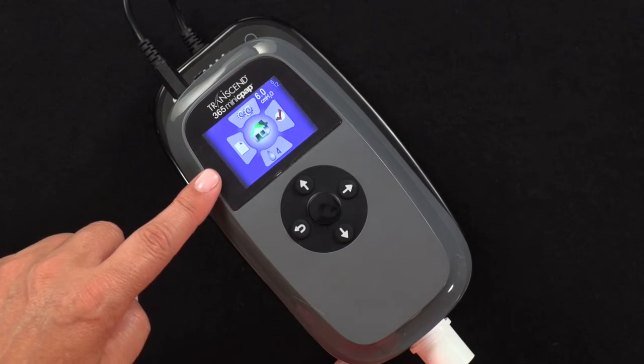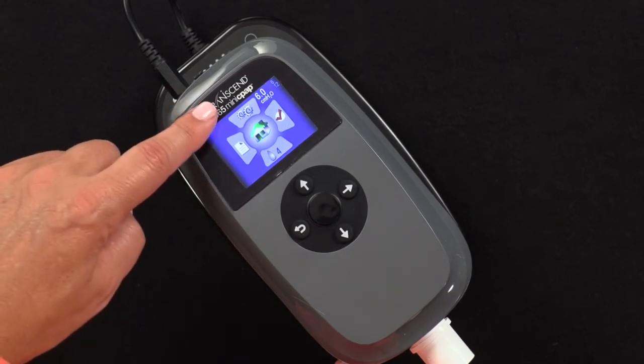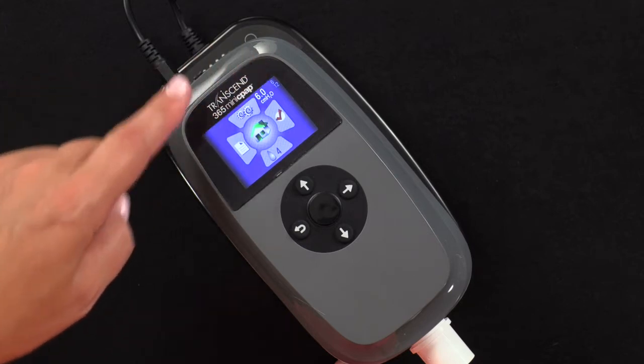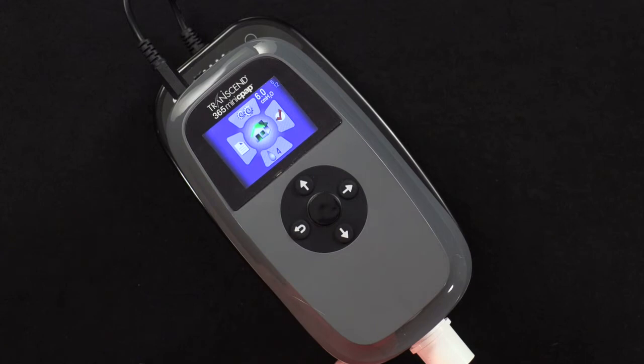When the CPAP is connected to a power source, the screen will illuminate, displaying the home screen. You can navigate to one of the 4 icons. Top, gears icon brings you to settings. Right, checkmark icon brings you to the last session of therapy. Bottom, water drop icon brings you to the humidifier setting. Left, paper icon brings you to detailed compliance data.